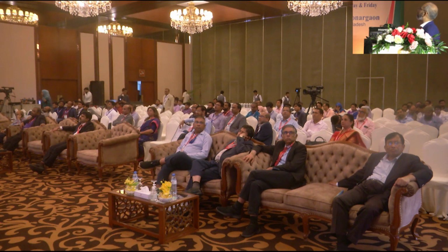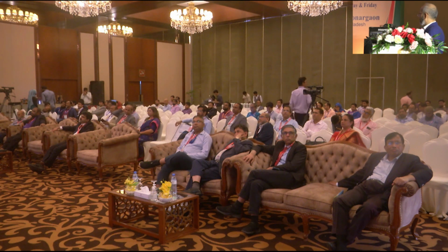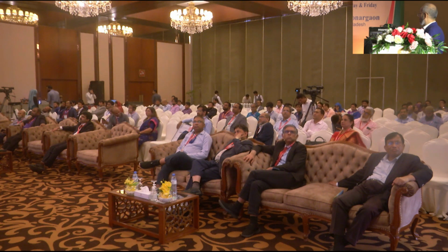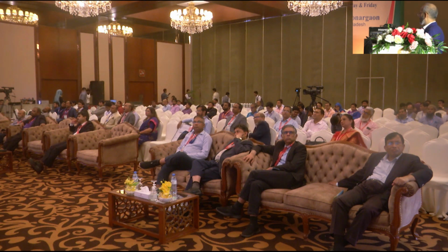So that's his left system. You can see that there's some calcification in the circumflex, and a high-grade stenosis in the circumflex. Next, in the AP cranial projection, you have that LAD. The first bifurcation is an LAD septal bifurcation, a large septal. There's enough calcification which is quite clearly visible. The second stenosis is at the second diagonal bifurcation. And the proximal LAD has clear calcification right up to the mid-segment.